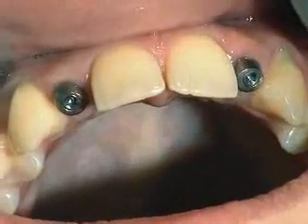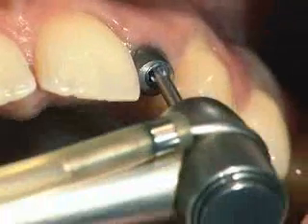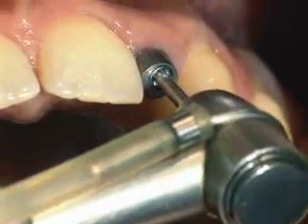After a healing period of three months, the internal configuration of the implant is cleaned and dried.